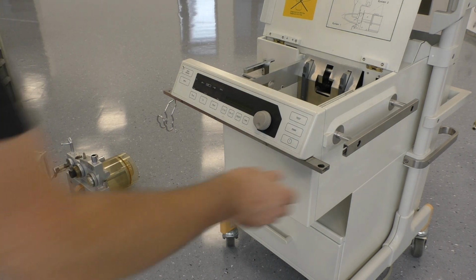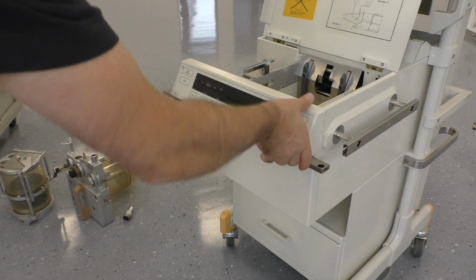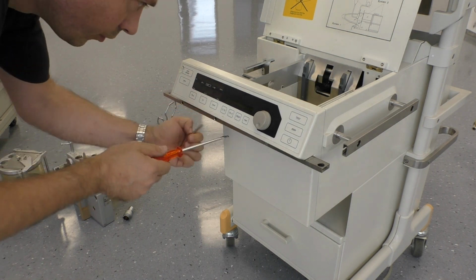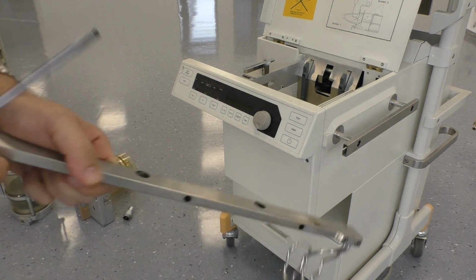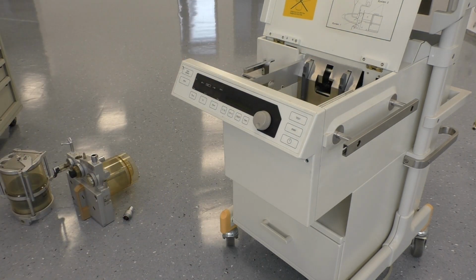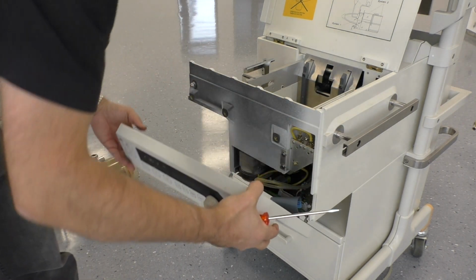Okay, that was only the bumper here. Let's see how we can remove that panel. If you need a source for stainless steel screws and other parts, buy one of these. Oh, okay.